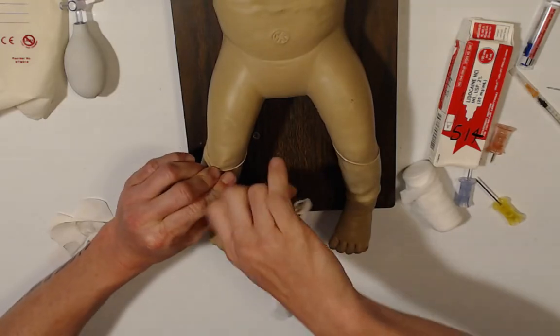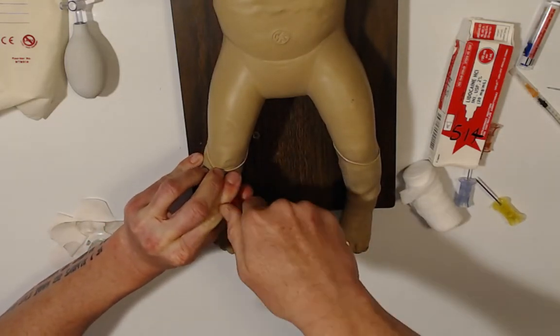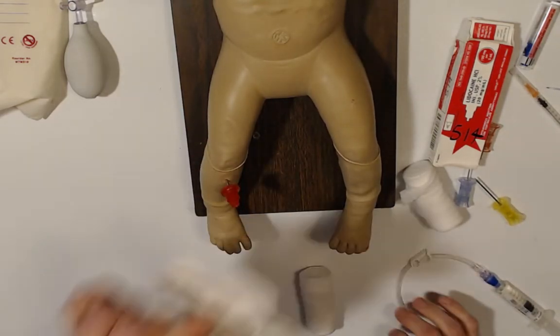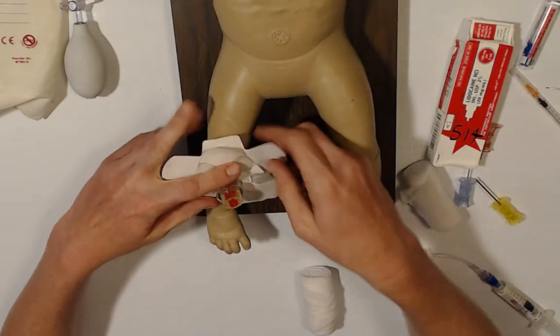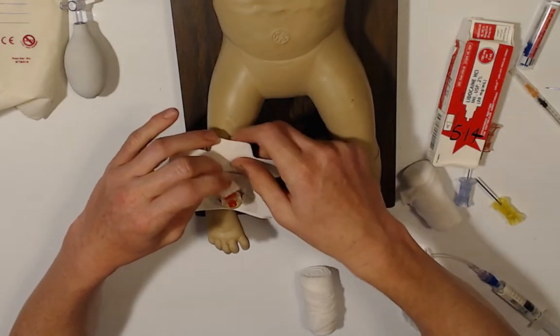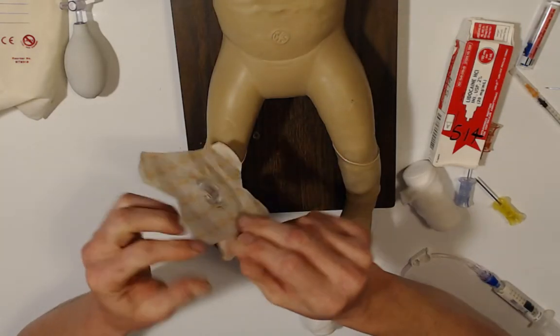Again, if we want to use the other device to secure it, this little triangle device, this would go over the top of it, okay? And then we would pull, I guess on this one, usually there's 2 pieces of wax paper.